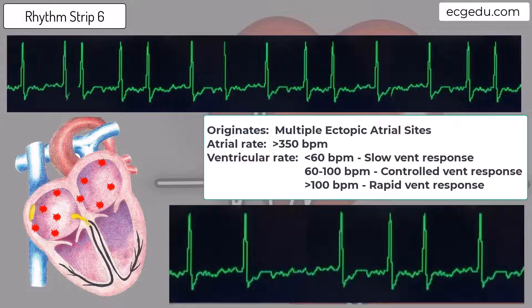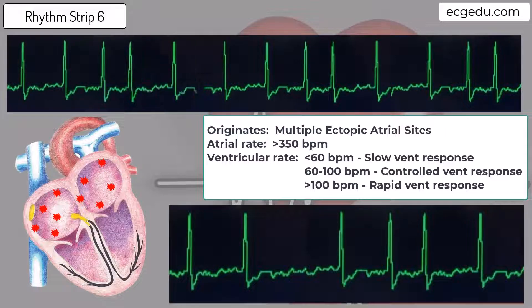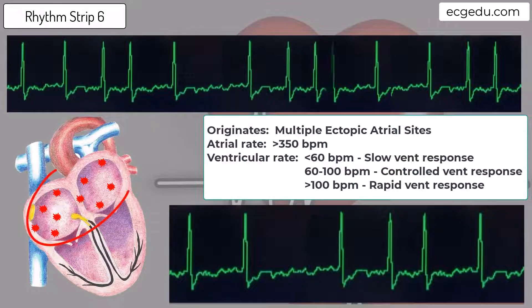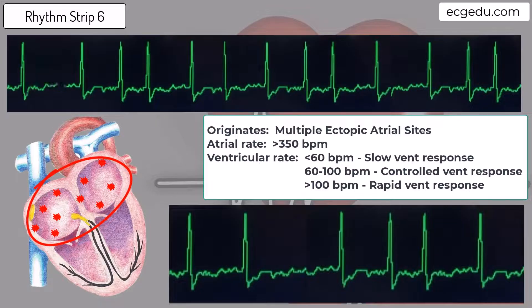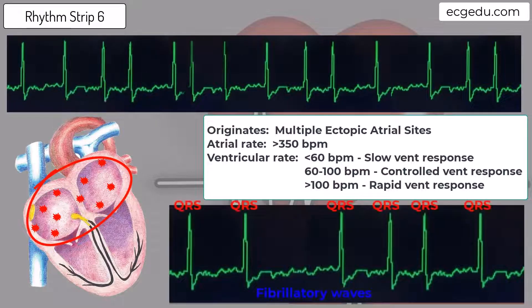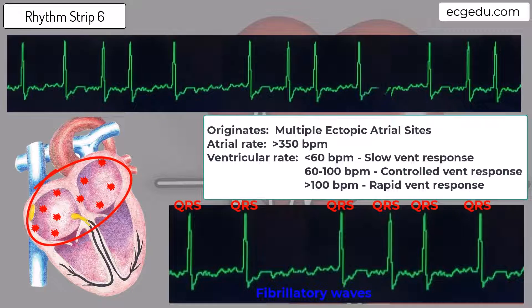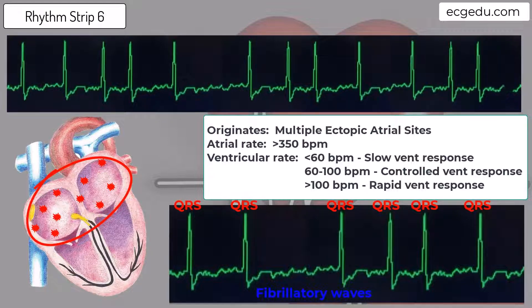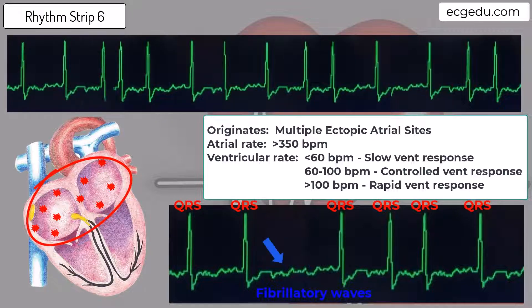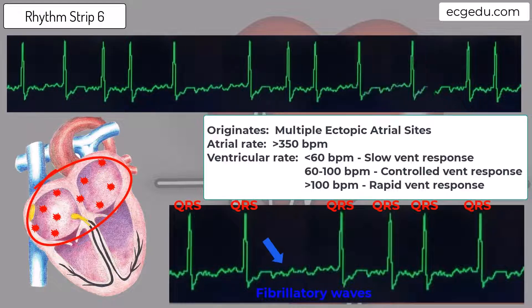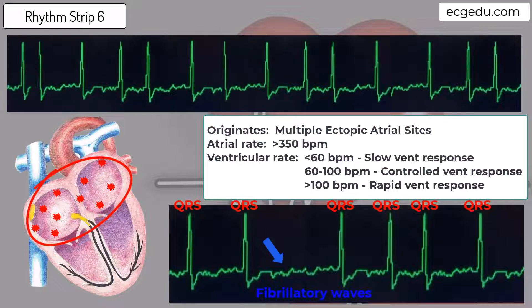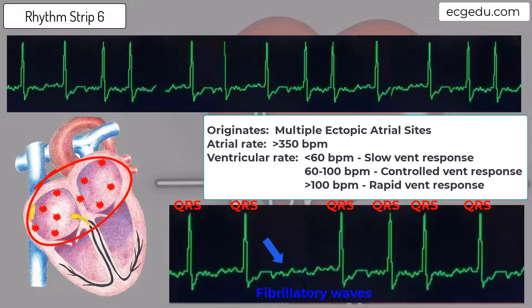This rhythm is Atrial Fibrillation. Atrial Fibrillation is a rhythm that originates from many ectopic sites within the atria, or upper chambers of the heart. In Atrial Fibrillation, the atrial impulses beat at a rate greater than 350 beats per minute, making the baseline of the ECG appear squiggly and chaotic. You will not see organized P-waves, but occasionally P-waves may look nearly normal.